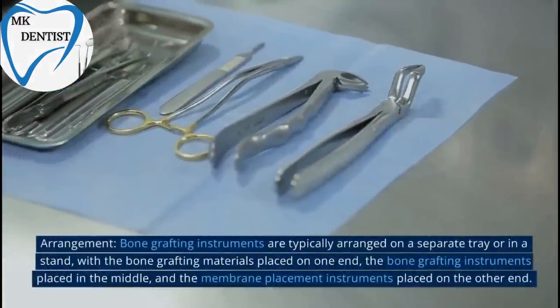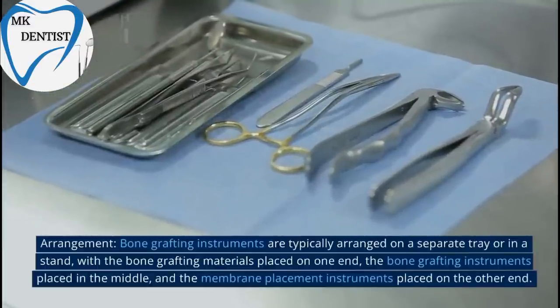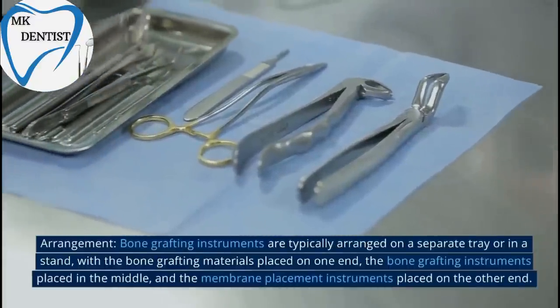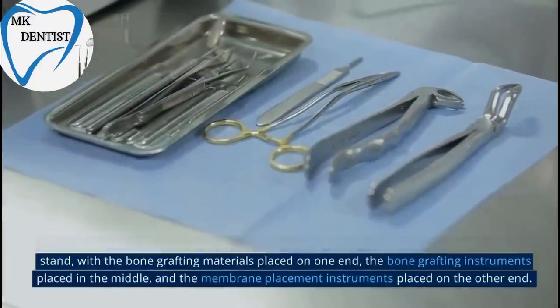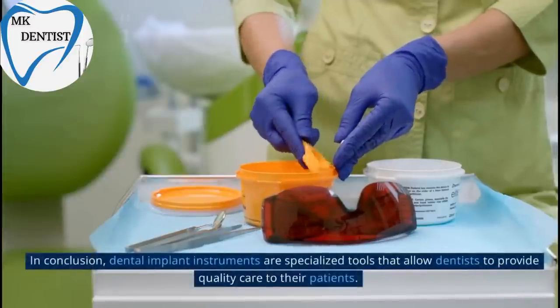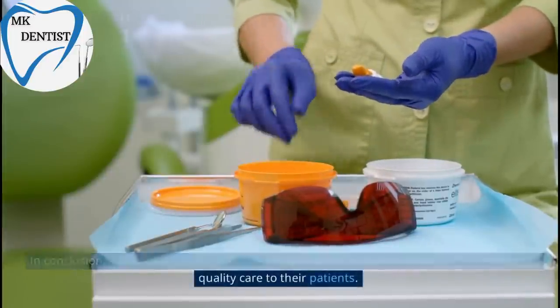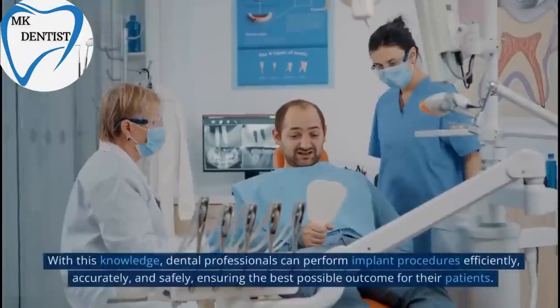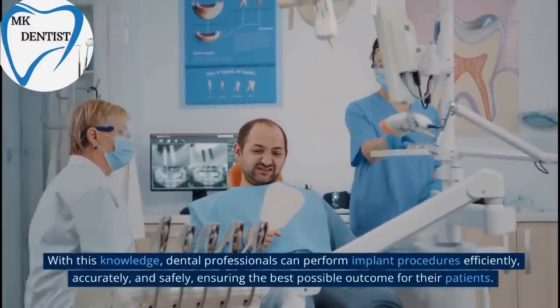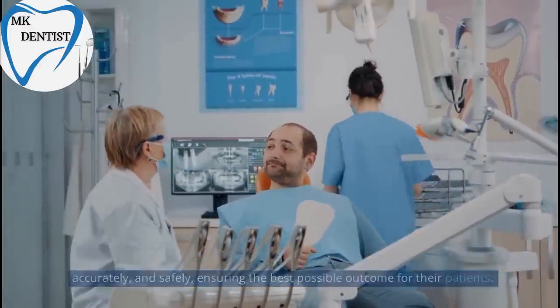Arrangement. Bone Grafting Instruments are typically arranged on a separate tray or in a stand, with the bone grafting materials placed on one end, the bone grafting instruments placed in the middle, and the membrane placement instruments placed on the other end. In conclusion, dental implant instruments are specialized tools that allow dentists to provide quality care to their patients. With this knowledge, dental professionals can perform implant procedures efficiently, accurately, and safely, ensuring the best possible outcome for their patients.